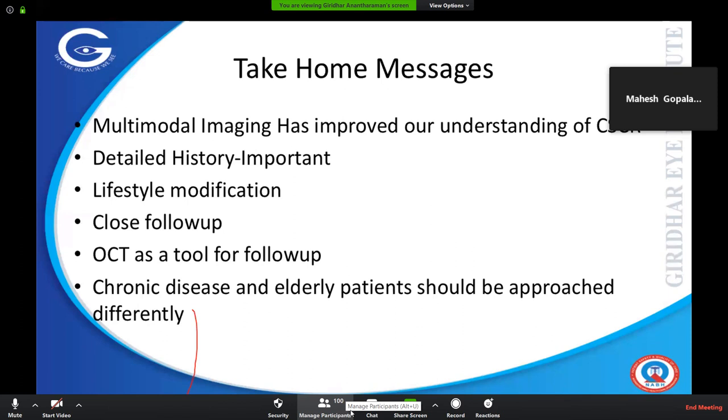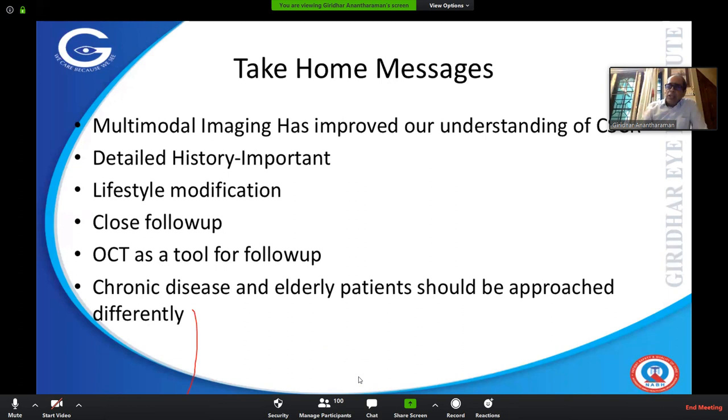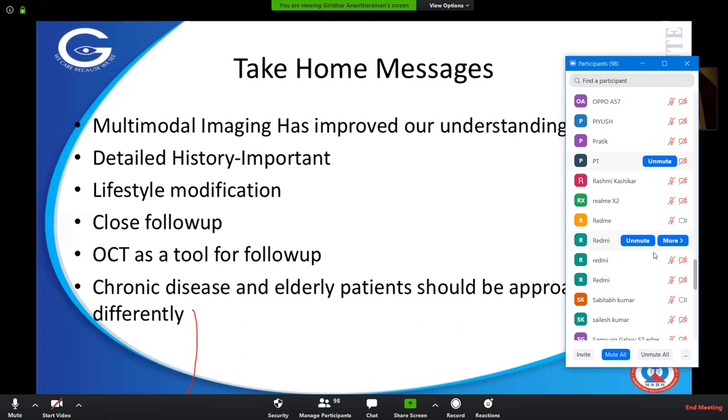One person has asked to elaborate on focal laser settings. Okay. Focal laser, I usually give a 50 micron spot size, and I titrate and just give one. You must localize the area of the leak very accurately. Now, how do you localize? With the retinal vessel. And you just give one or two burns. That is enough. Start with about 50 or 60 milliwatt power and just give a mild treatment. That is my way, how I treat.